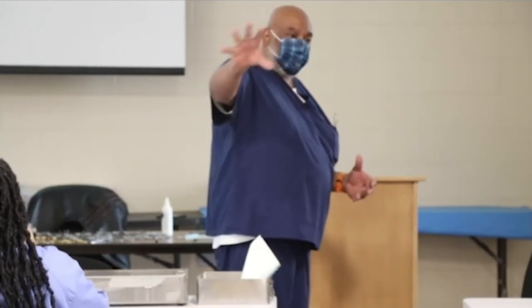True, Sasha? So the other thing, when one comes out after it's cool enough, somebody's got to put them away so that when the case cart team starts getting ready for the cases the next day, they're on the shelf, okay? Plus, you guys have the responsibility of documentation. What's my rule with documentation? If it's not documented, it didn't happen, okay? And your documentation always needs to be clear and concise. Remember that.